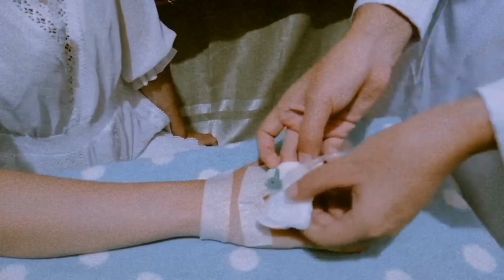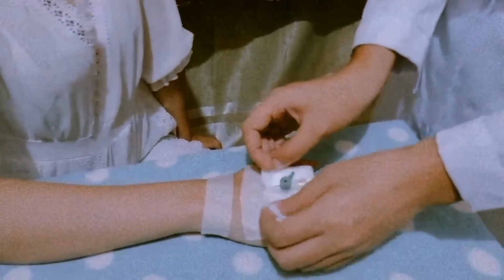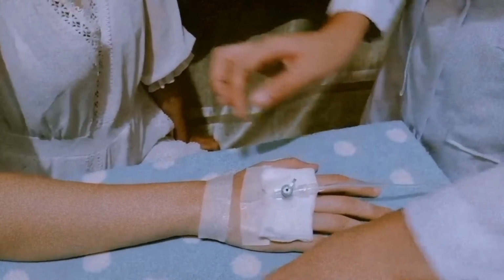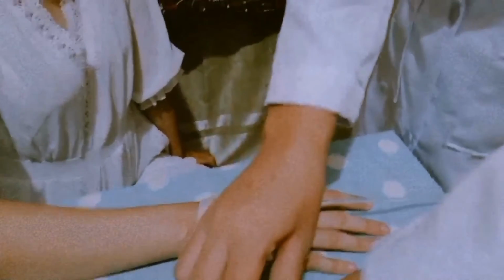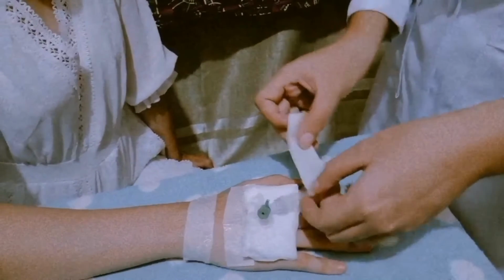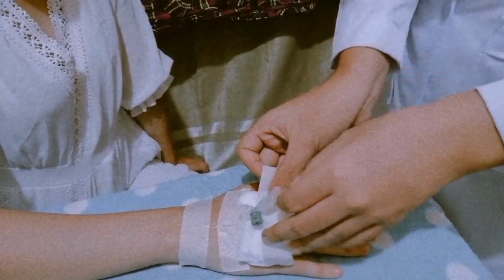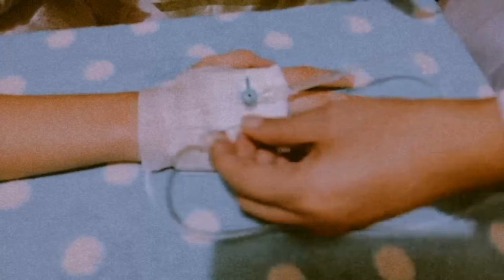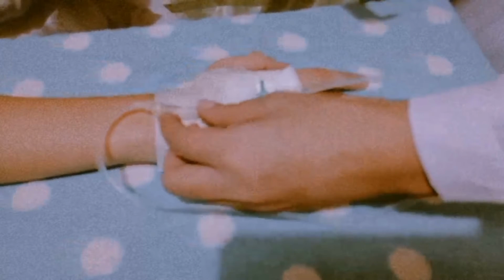Next is to support the needle with a small piece of gauze or tissue paper under the hub, if necessary, to keep the needle in place. The pressure of the wall of the vein does not offer resistance to the movement of the needle. The weight of the tubing is sufficient to pull the needle out of the vein if it is not well anchored. Loop the tubing near the site of the entry and anchor it with plaster to prevent pulling of the needle.